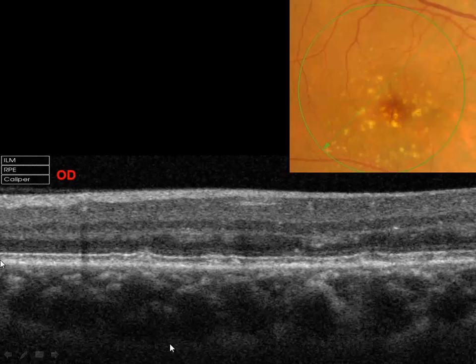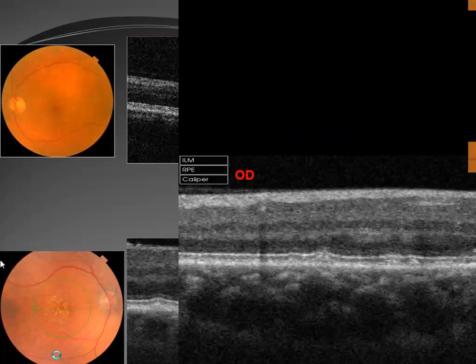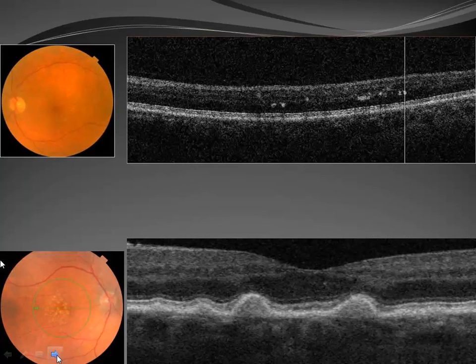We don't really know how often. An article was published this year, just a couple of months ago, by some people in New York from Larry Yannuzzi's group. Rick Spaide is a specific person that noticed this first and published this major article. So we're now calling these subretinal drusen-like deposits, instead of being just under the retinal pigment epithelium. So you can actually have them in the same eye.